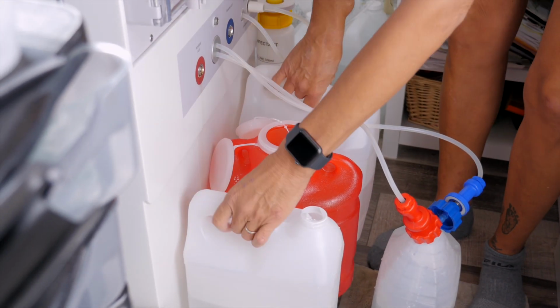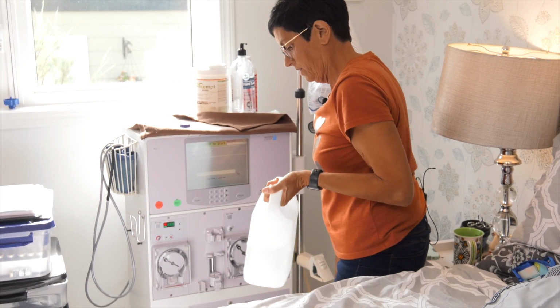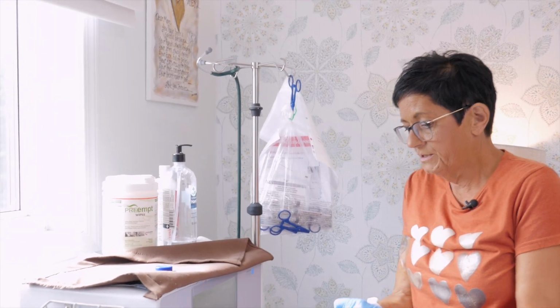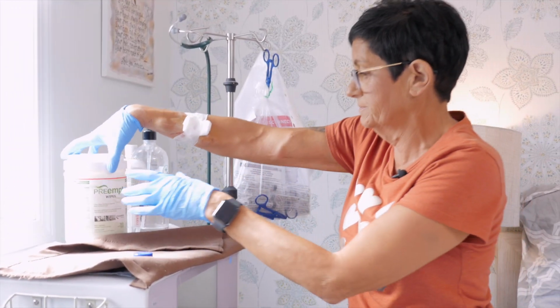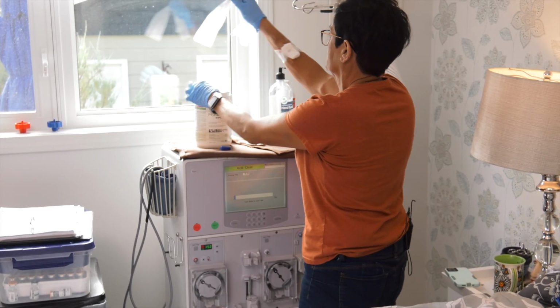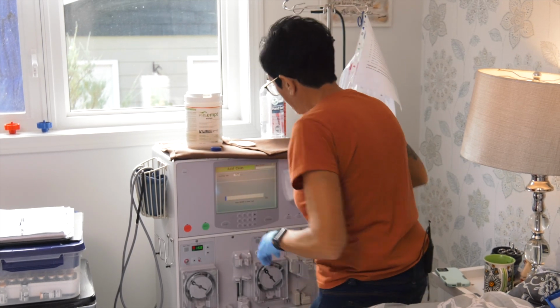There. Then you would dispose of these. This one goes in your toilet, and this one goes in your sink. And when you put your chemicals or your bath in the drain, you want to make sure to rinse them and flush your toilet really well. Otherwise, they can bother your plumbing.